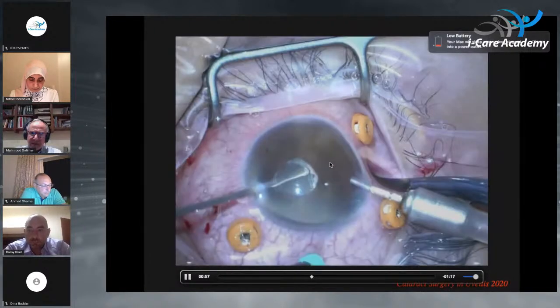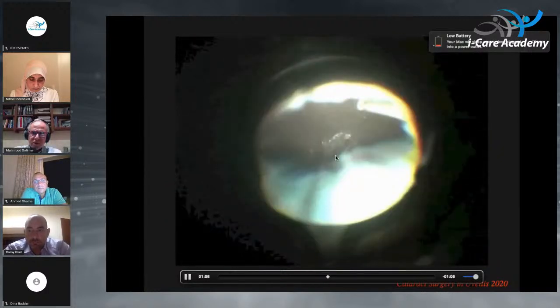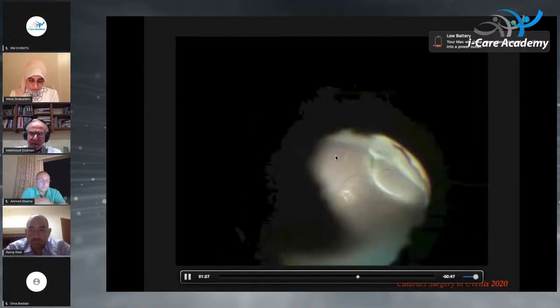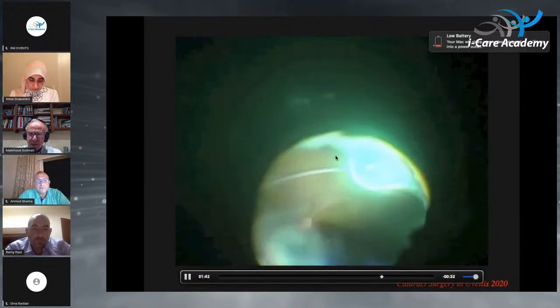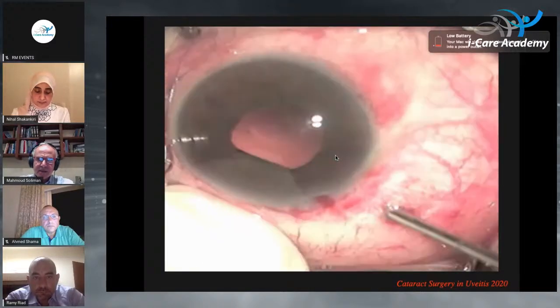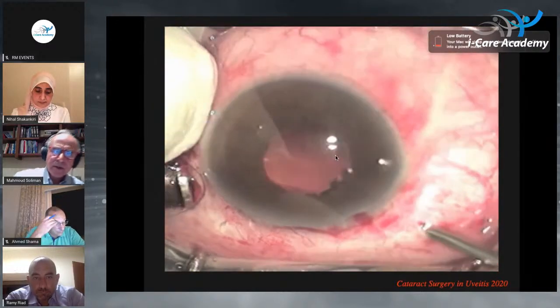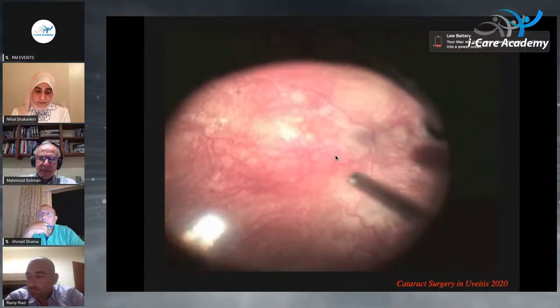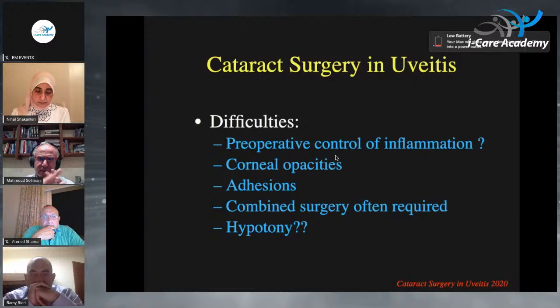So you need to clean inside, and you need to clear the vitreous membranes here. Epiretinal membrane, a small epiretinal membrane, will be removed. And in this patient, he had a small break. You can do laser and the patient did actually quite well later on. All right. Sometimes, like this patient with VKH, again, the anterior segment was disrupted. You need to do a lensectomy and clean the visual axis properly. And in these patients, you need to also remove all the capsular remnants in order to leave the visual axis very clean.